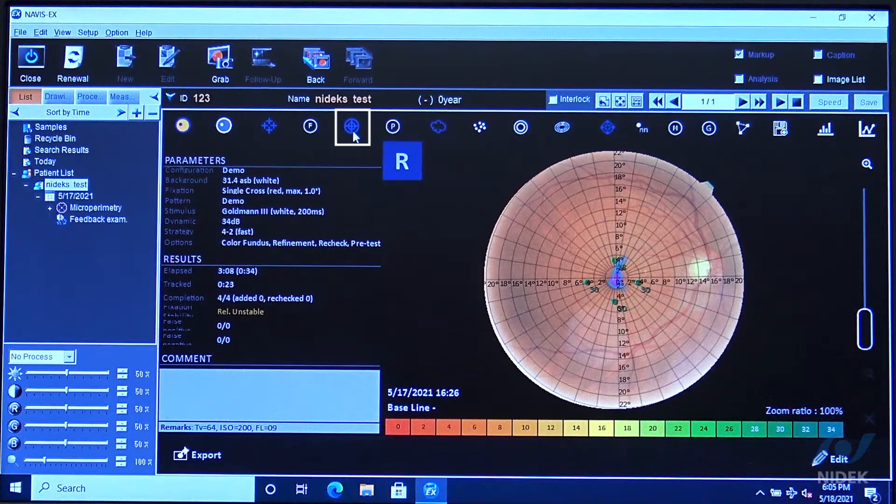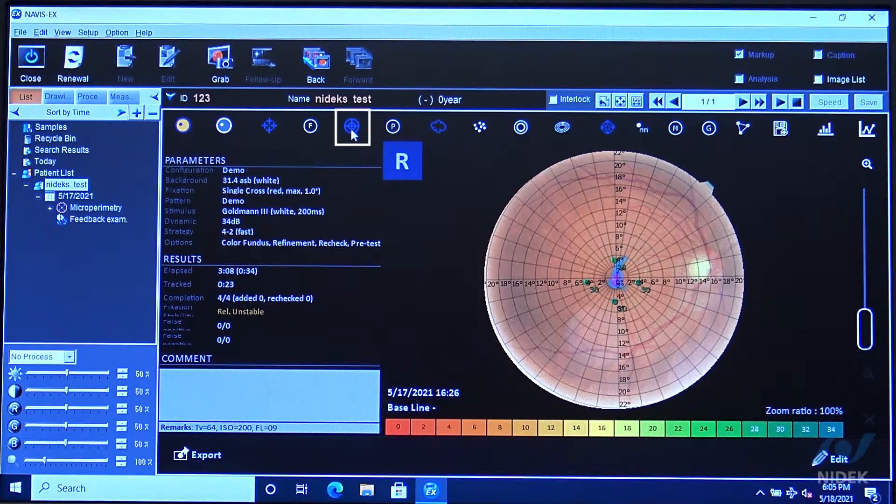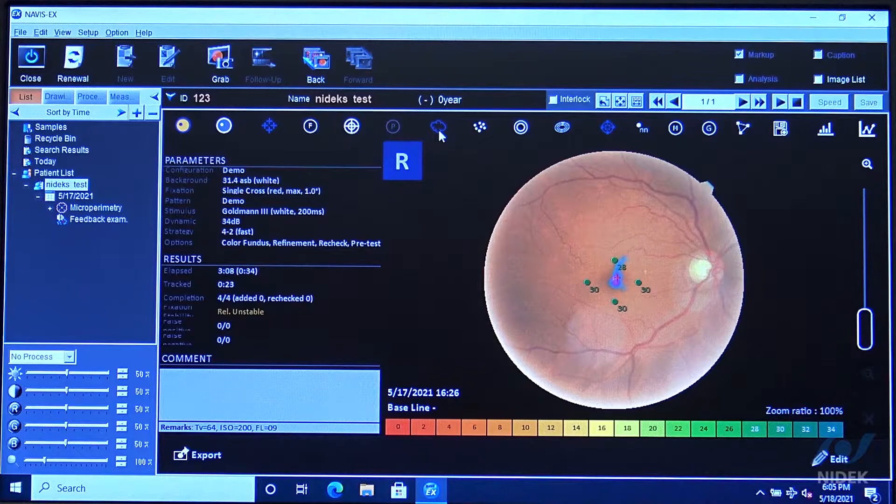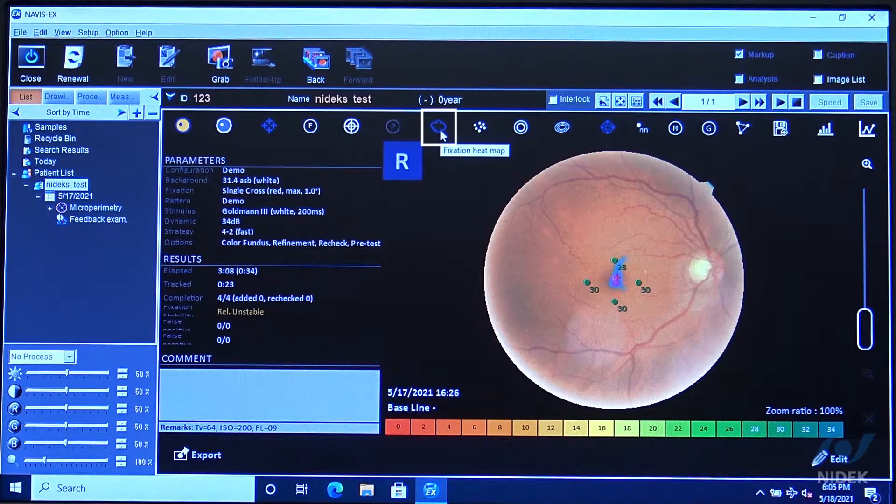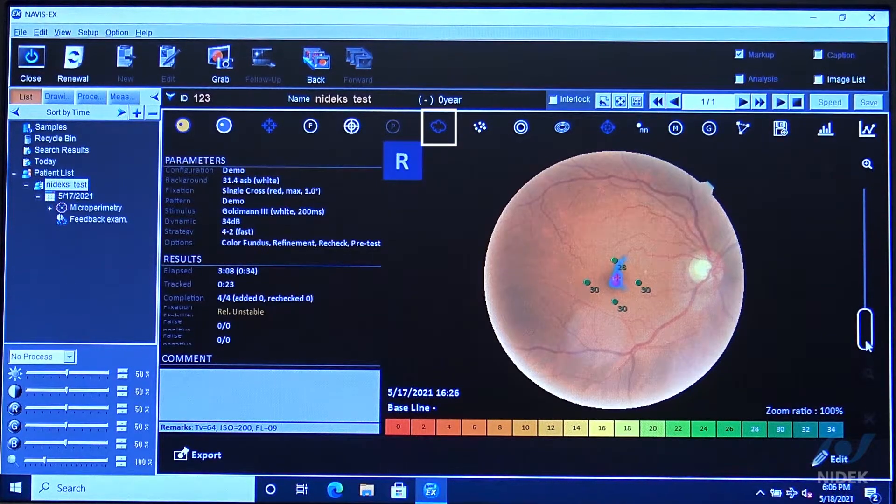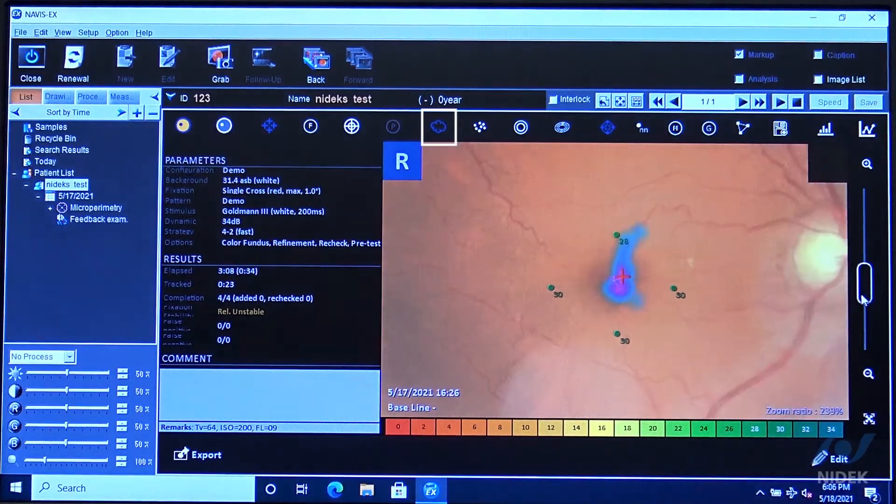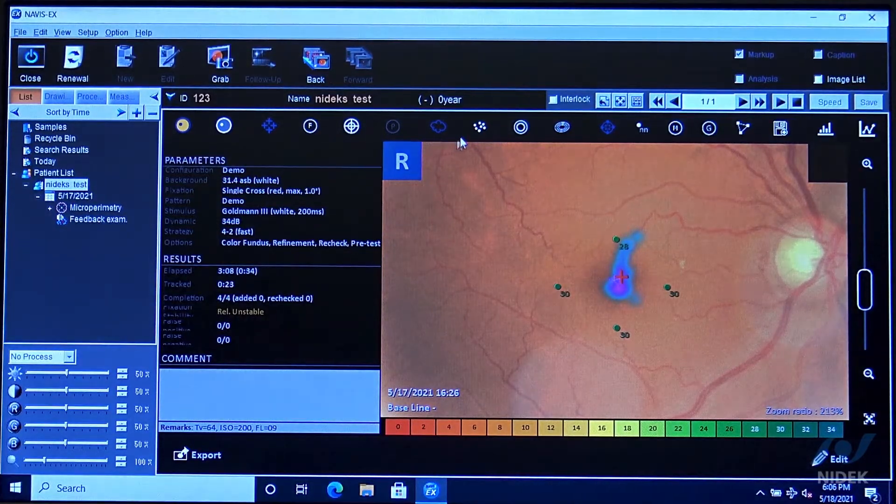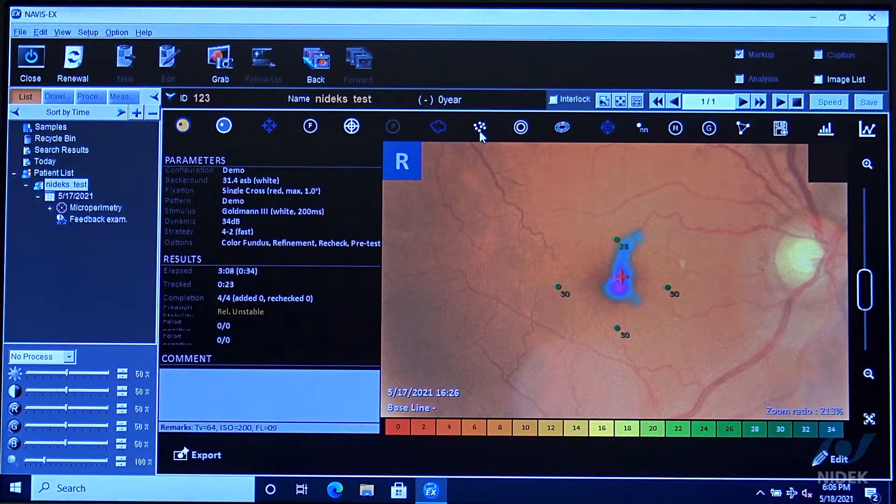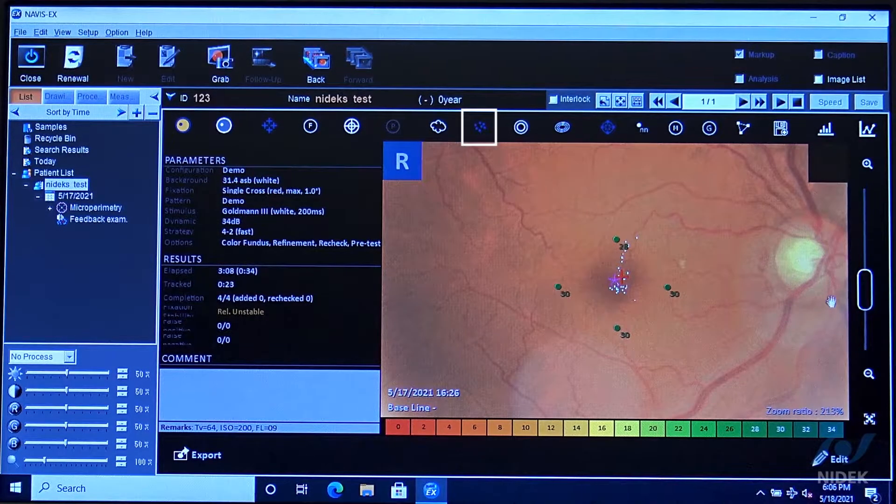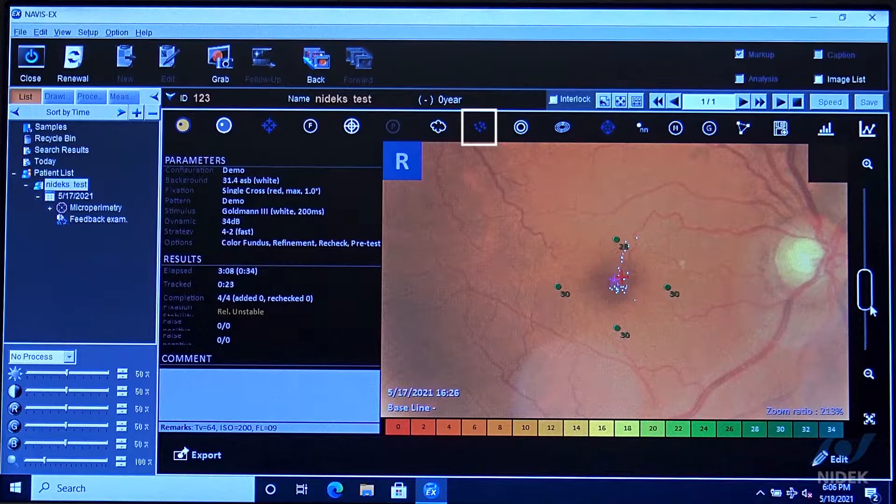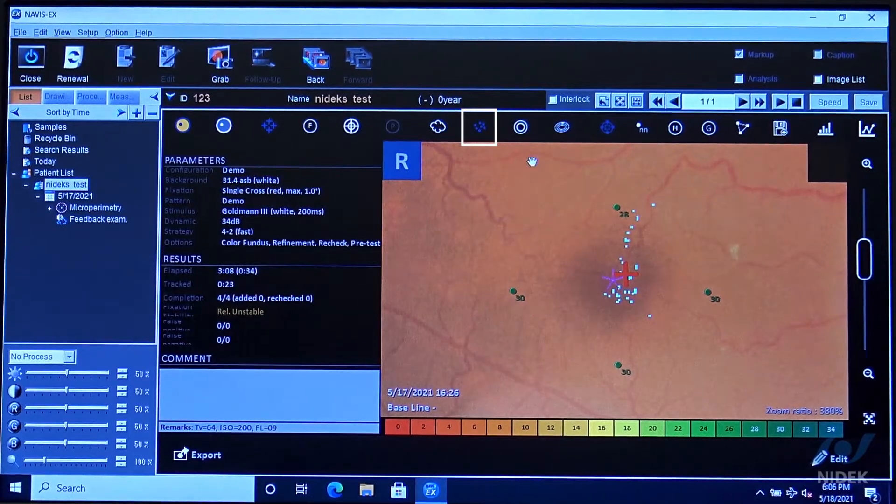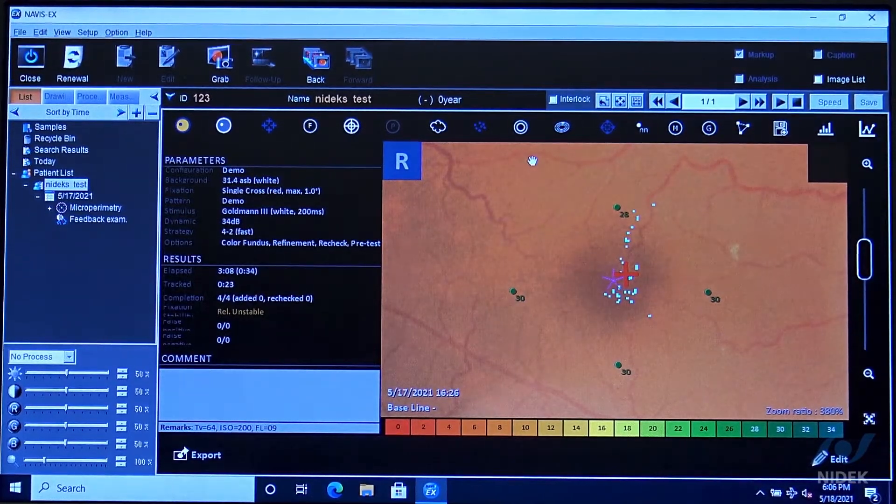This is going to be our grid. This is what we call our heat map of fixation. As you can see here, we have a heat map of fixation or we have the fixation dots. This is where the patient looked and looked back to the fixation target.